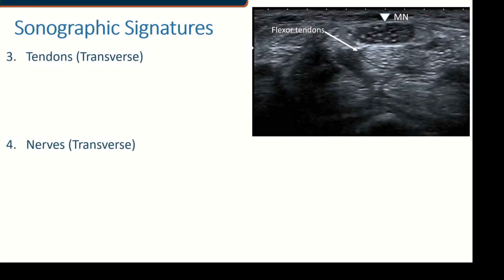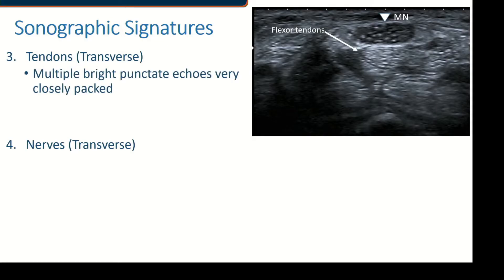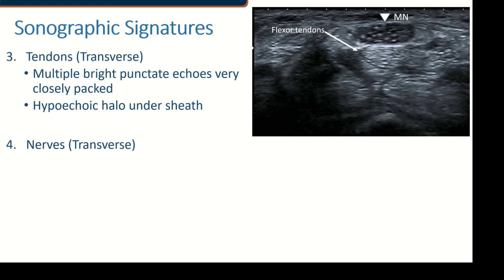Looking at tendons and nerves in transverse: tendons will display as multiple bright punctate echoes very close together. You can really appreciate, with the median nerve above it, how much brighter the tendon is. You will sometimes see a hypoechoic halo around the tendon sheath — that's quite common and is another telltale sign. That halo is just some loose areolar tissue between the tendon sheath and the tendon fibers themselves.